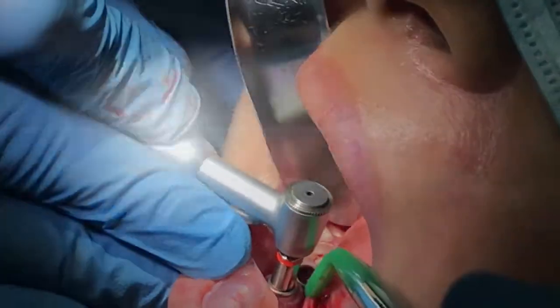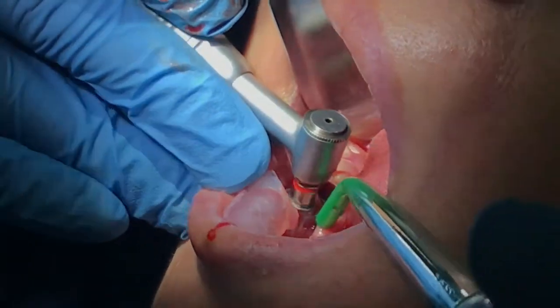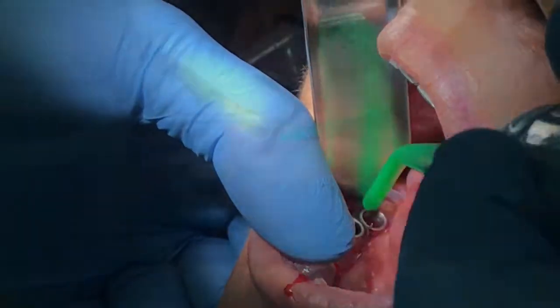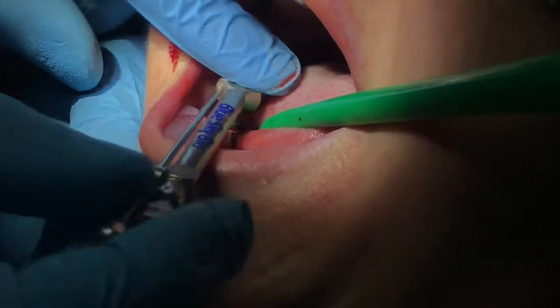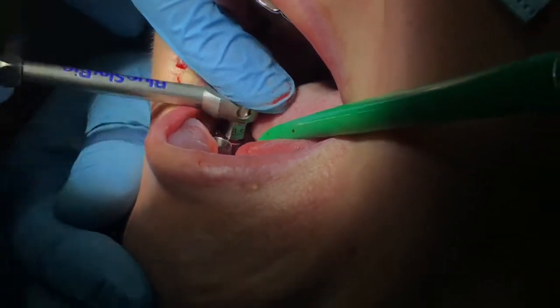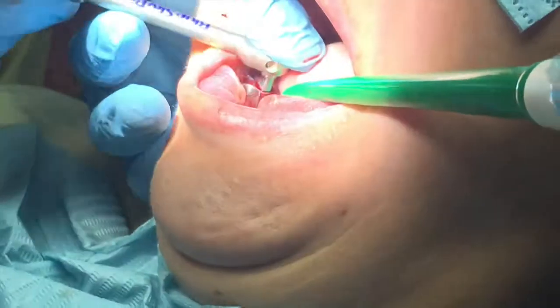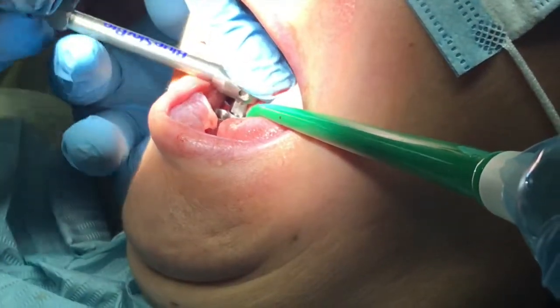We are jumping onto our final drill, the 3.2. Our goal is to place 4.3 diameter implants by 11.5. Once we achieve that, we under-prep by one size, and now manually we are ratcheting both of the implants — this can also be done via motor. Here we have 100% control. Everything is done through the guide.